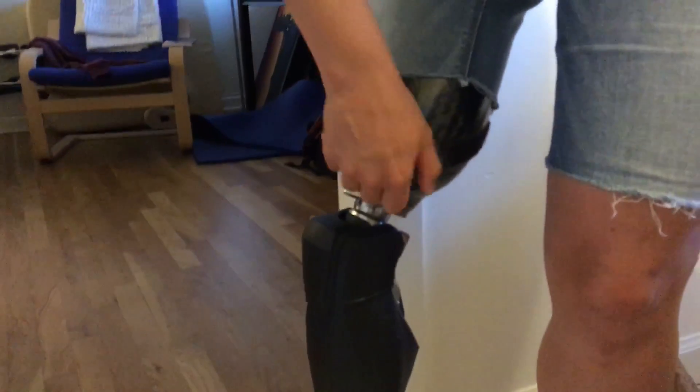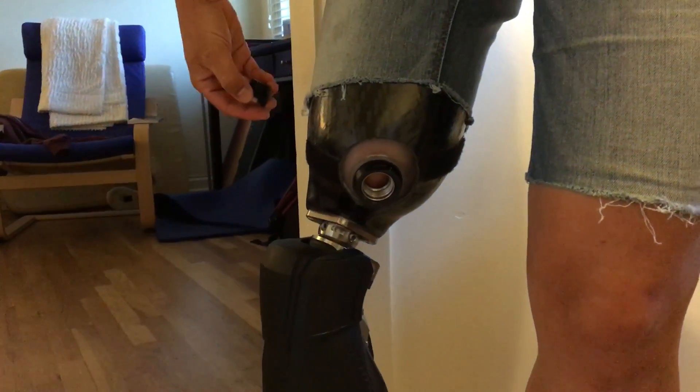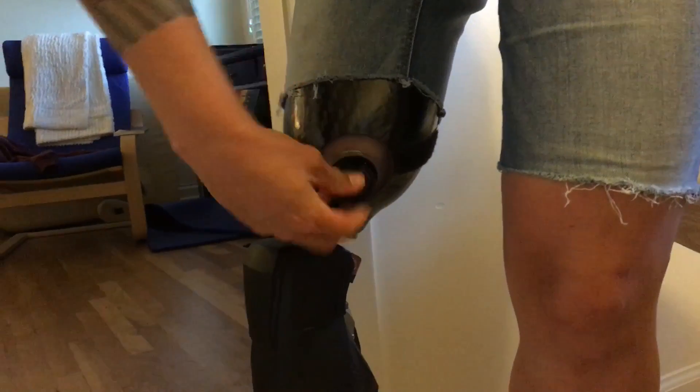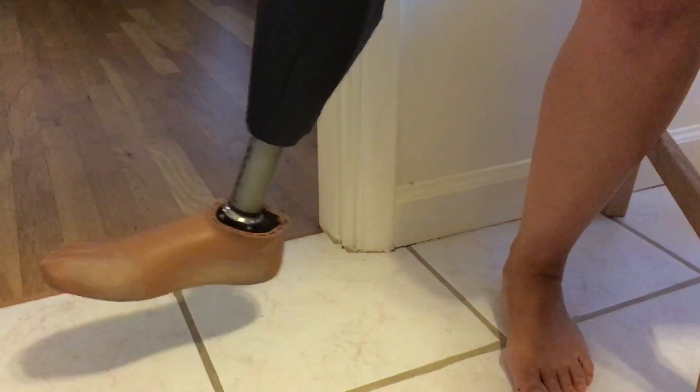This valve right here, if I unscrew it, it's what releases the suction. If I lift up right now, my leg would come off. You screw it back on, and I'm in there. There's no way this thing's coming off.